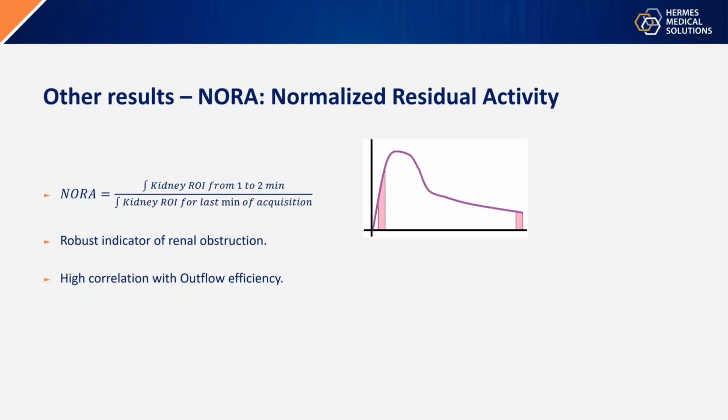Sorry to interrupt you. It'd be possible to draw the kidney region not including the pelvis. Maybe that would be the... Might be. That would be the Nora just for the cortex part of it then. But maybe that would be a useful thing to know. It's not a bad idea, especially if you see on the images that the pelvis is so big.